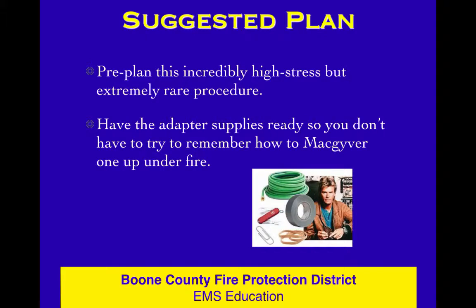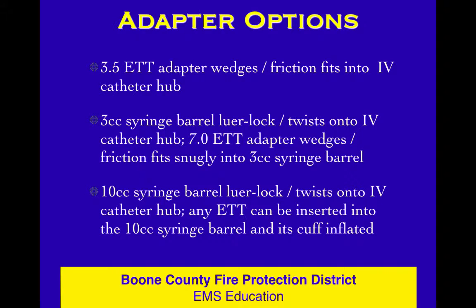I think the bigger deal here is the adapter stuff, and really you ought to pre-plan this. Don't try to play MacGyver when stuff's going wrong. There's no duct tape involved in this; it's one of the only things I can think of in the universe where duct tape's not a good idea. You want to pre-plan this and get your supplies ready. Have them in a little bag, have them in a little kit. You're talking about a cannot intubate, cannot oxygenate on a pediatric patient. This is incredibly low frequency, very high criticality. So you should pre-plan, you should train, and part of that is this adapter option.